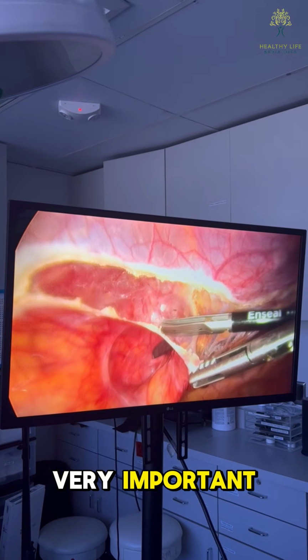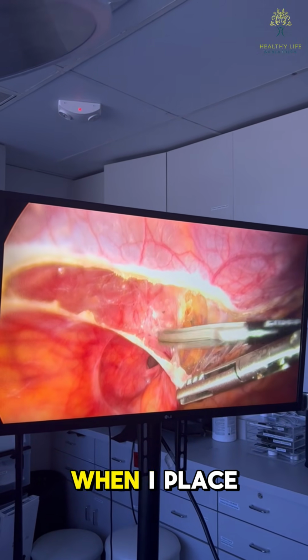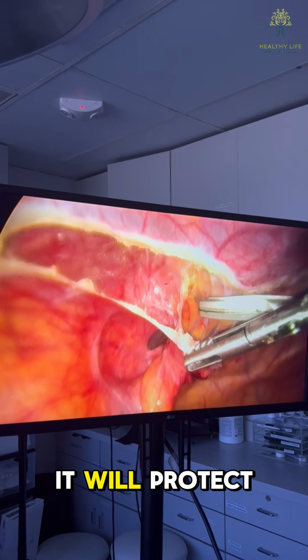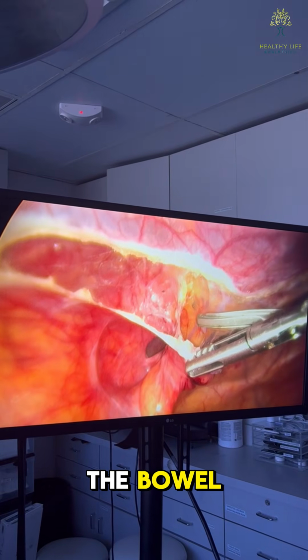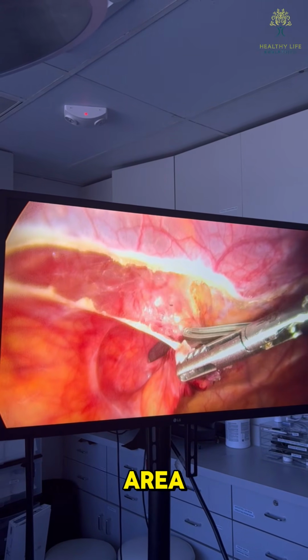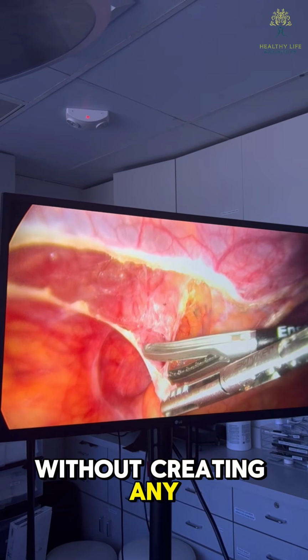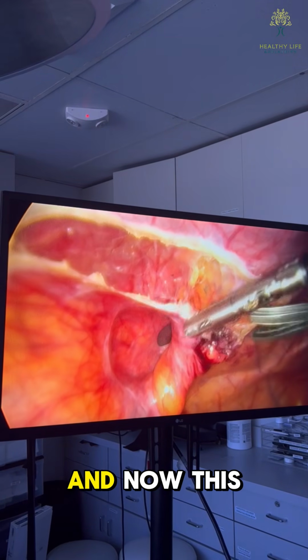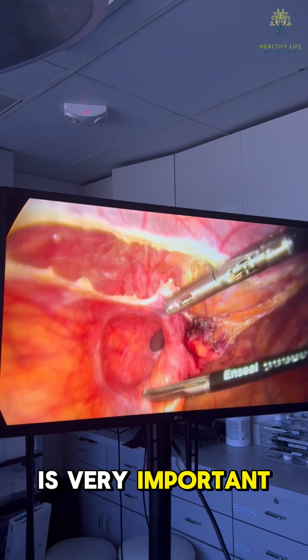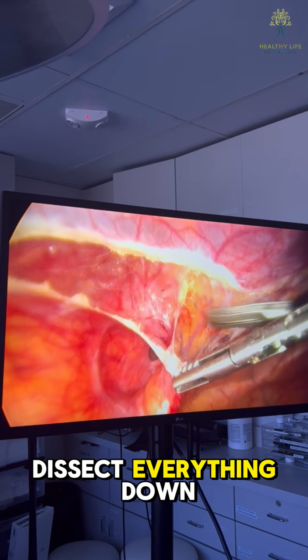This tiny little covering is very important because when I place the mesh into this cavity in the floor of the pelvis, it will protect the mesh from the bowel and allows me to place the mesh in this area without creating any kind of adhesions. And now this structure over here is very important, right down here. So we're going to dissect everything down.